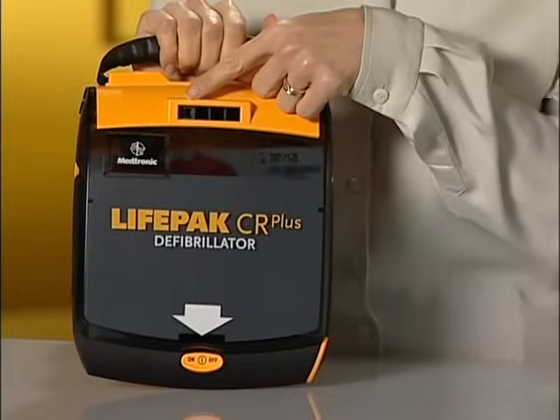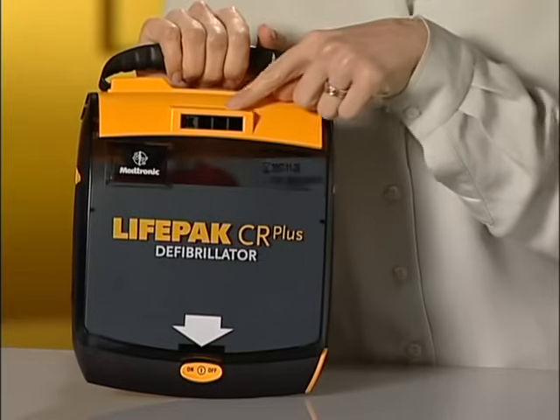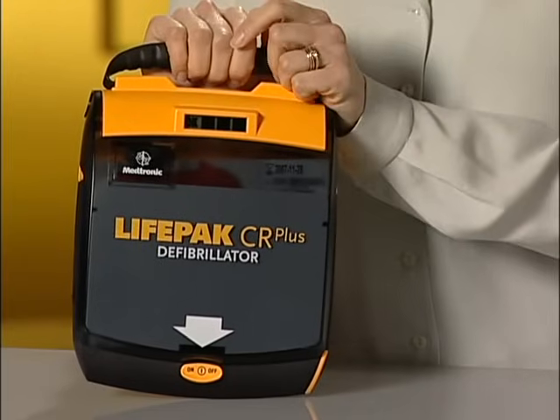The LifePak AED is easy to maintain. It does its own self-test at regular intervals to be sure it's ready. If it senses anything you should know about, it will change the OK symbol here to another symbol. You should check this display periodically to make sure it says OK. If you see another symbol instead of OK, look it up in the manual to see what it means and what you should do about it.